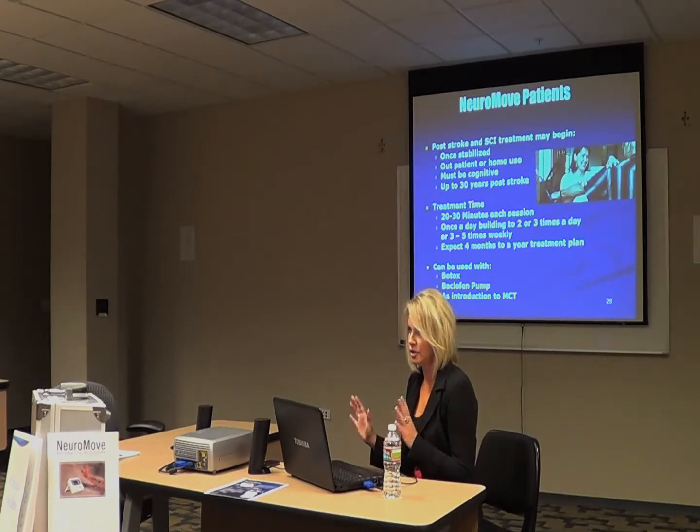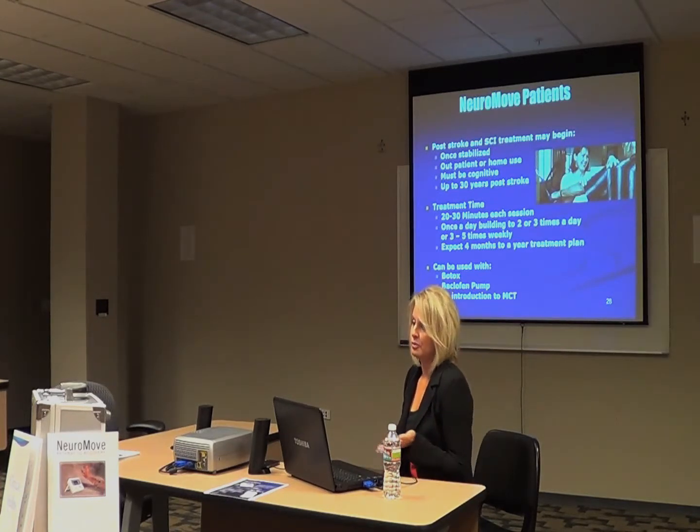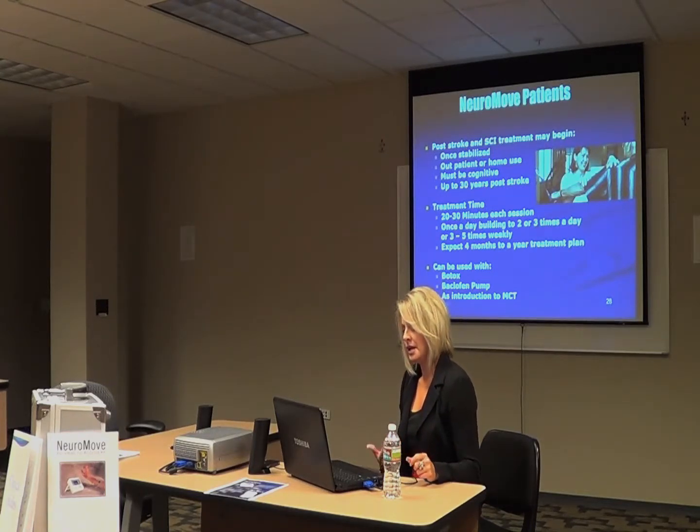So just an idea of what you might have to do. Treatment time is 20 to 30 minutes each session, once a day building to 2 to 3 times a day. This would be for the patient that takes it home, because you won't have time for that. Expect a 4 month to a year treatment plan.